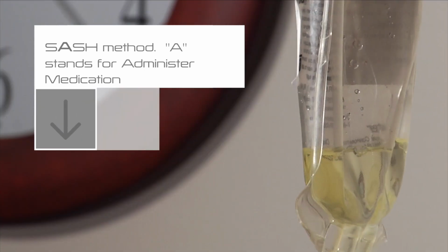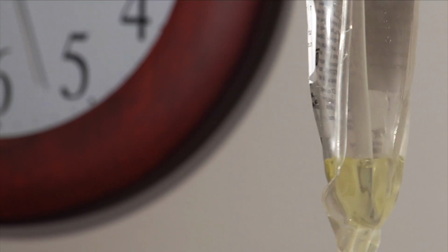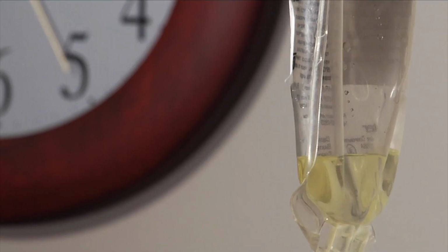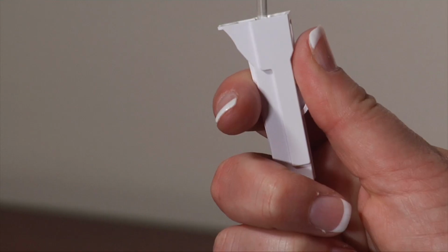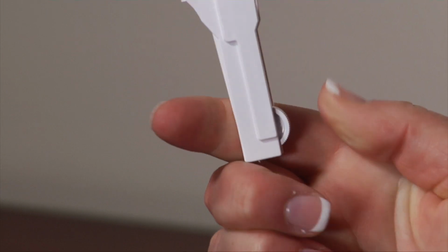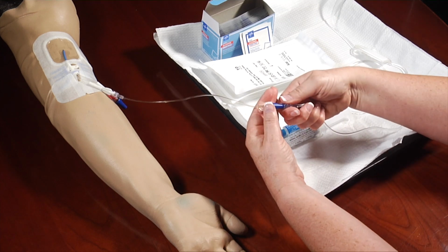Monitor your infusion progress by observing appropriate number of drops in the drip chamber. Monitor the flow rate frequently. When the medication bag is empty and drops of medication are no longer seen in the drip chamber, the infusion is complete. Close the roller clamp. Disconnect the bag from the injection cap of your IV catheter.